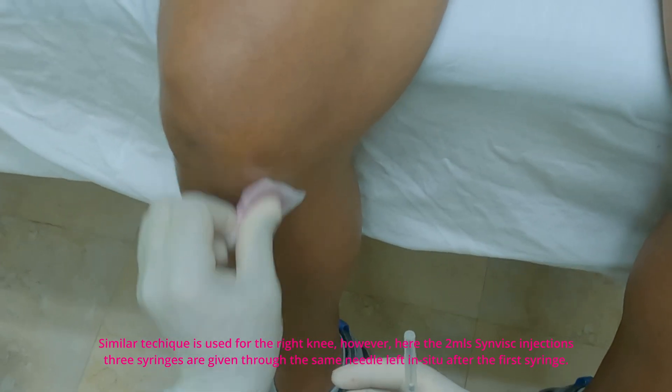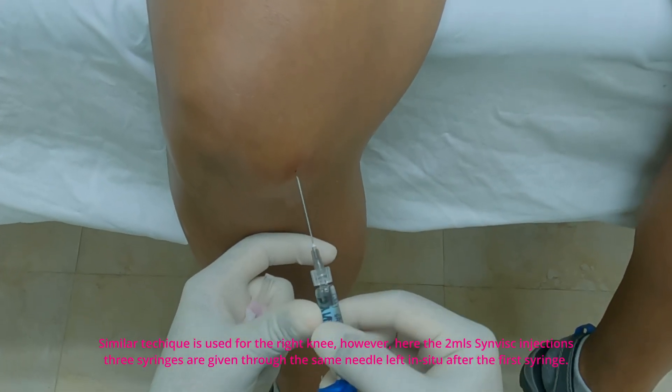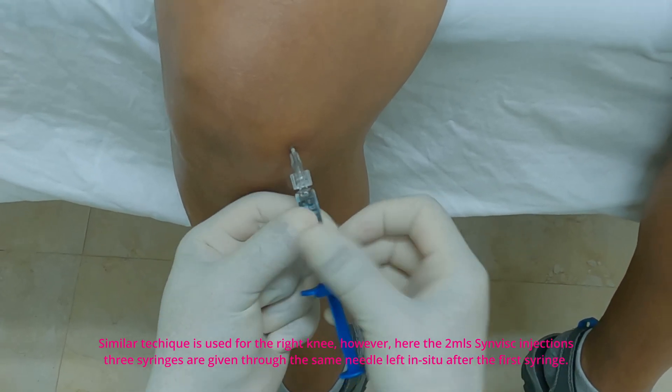A similar technique is used for the right knee. However, here the 2 ml Synvisc injections — 3 syringes — are given through the same needle left in situ after the first syringe injection.